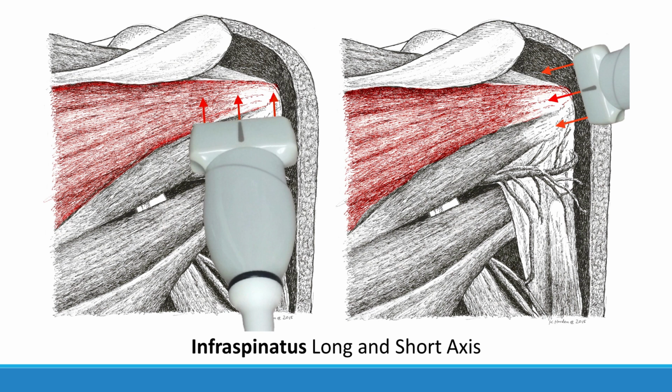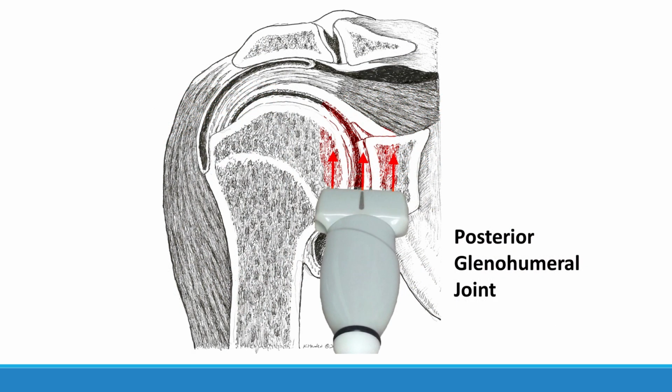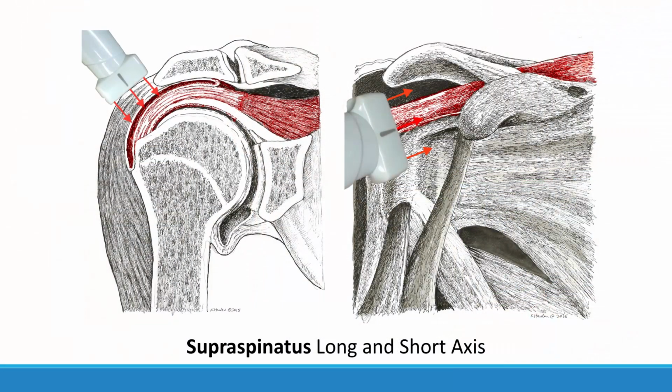And in that view, we're going to look at the posterior superior rim of the glenoid labrum and look at its quality of gliding and its relationship with the humeral head dynamically. That's the one view in the shoulder where we get a decent picture of the labrum. And next, we'll reposition the patient and look at the supraspinatus and the anatomic footprint of that tendon.